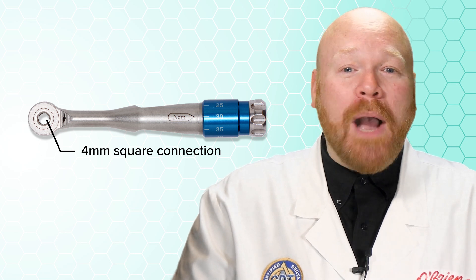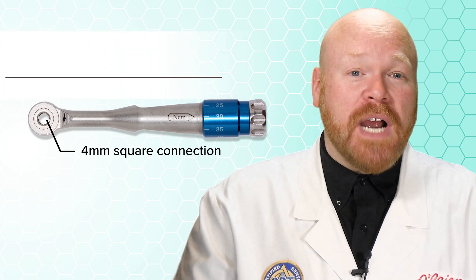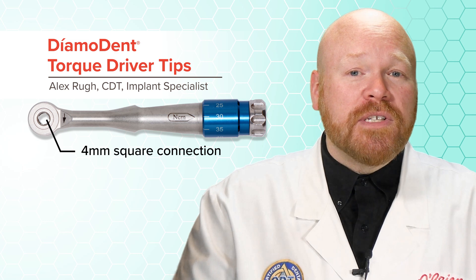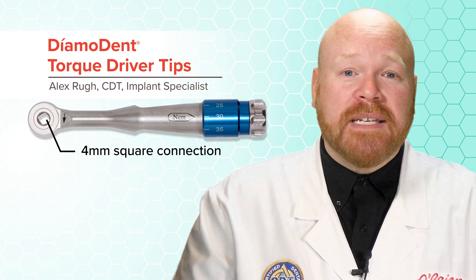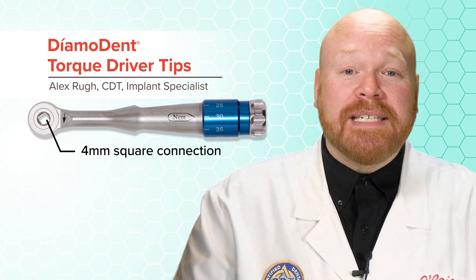In this video, I want to show you a really cool set of driver tips that you can use in those universal drivers. They're sold by Diamadent, and the reason they're so great is that each type has a different colored rubber gasket on it, which makes them really easy to identify.